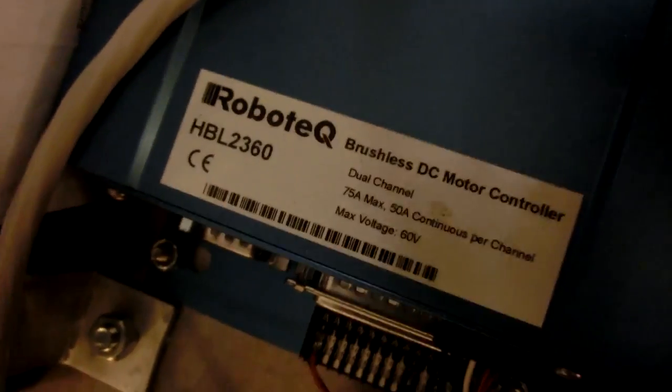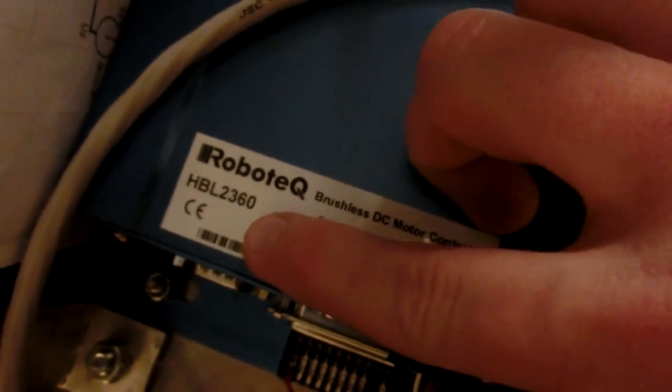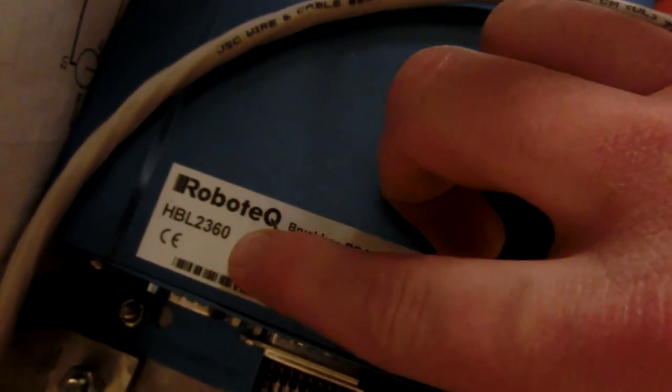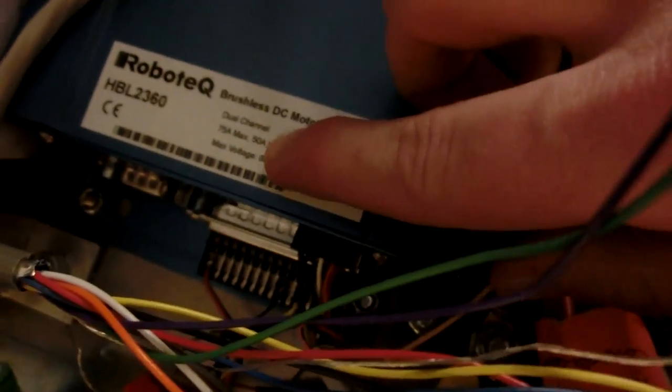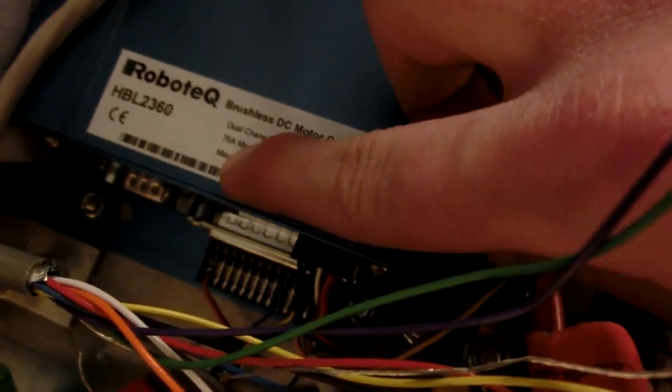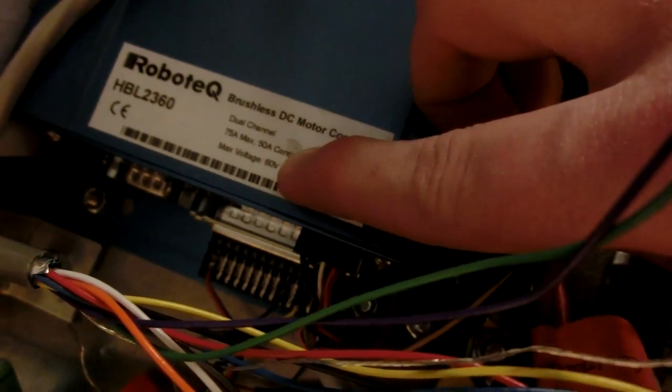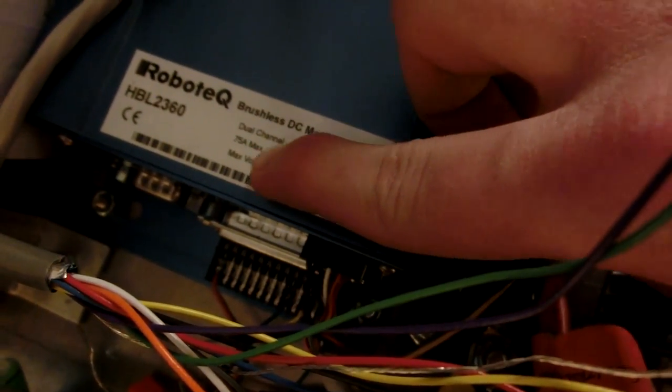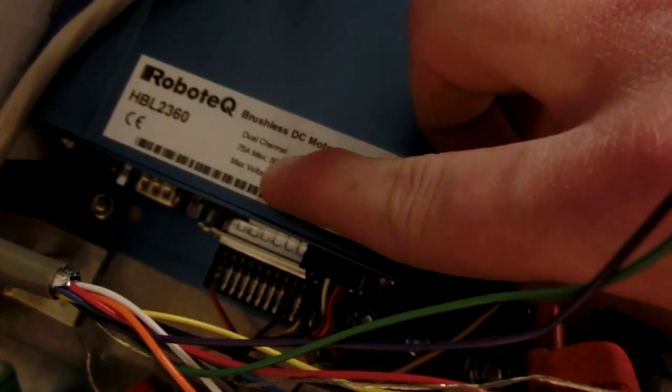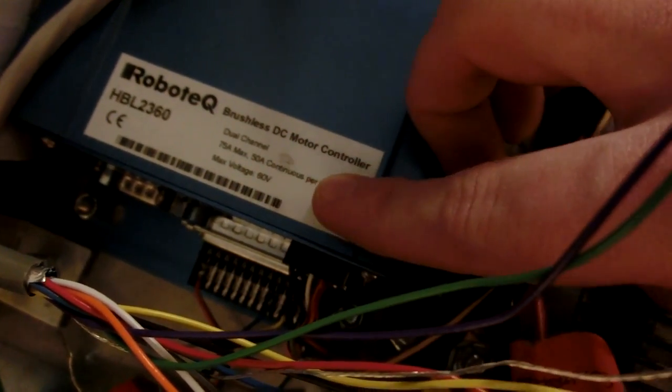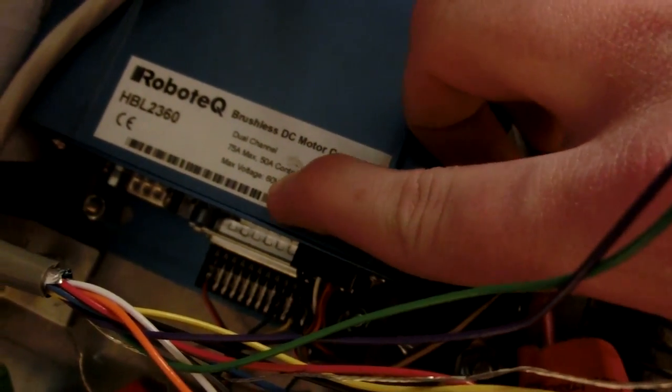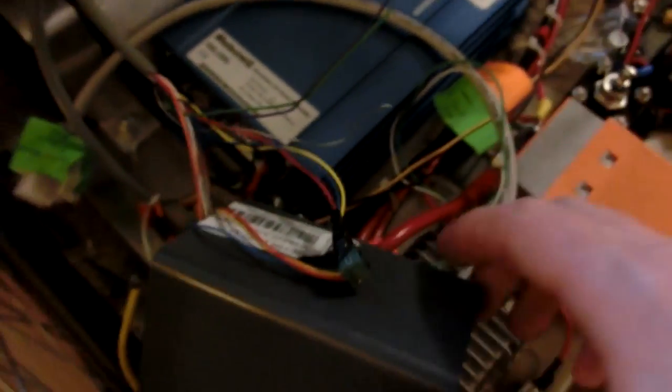So this is a Roboteq HBL 2360 48 volt 75 amp max and 75 amp max 50 amp continuous 60 volt. Oh wow so it's actually like a variable voltage one? Yeah. Well that's pretty cool.